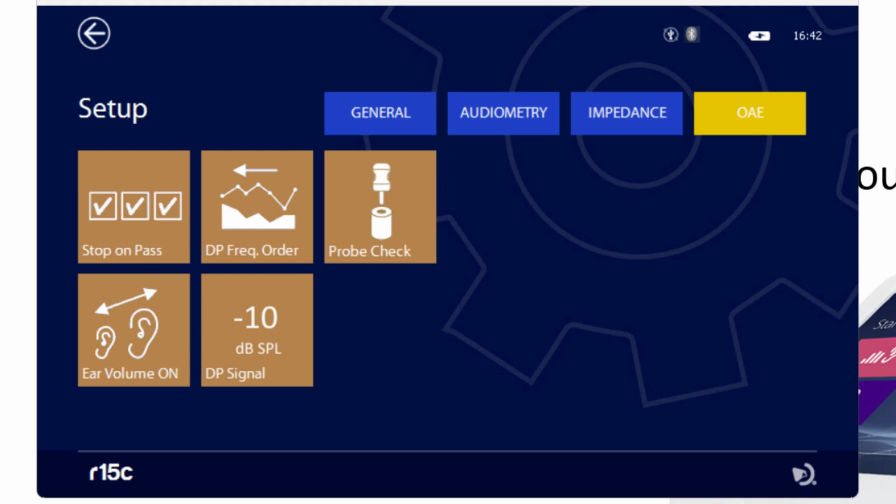The second thing that you can do to make things slightly easier is to always make sure that DPOE is measuring from the highest frequency first and the lowest frequency last. Lowest frequencies have more noise content, so a smaller chance of being a pass. By starting at the higher frequencies, the chance is bigger that after 3 measurement points, you already reach that pass, and then the measurement can stop. So those two are for optimization. Then I'll explain the bottom two as well.